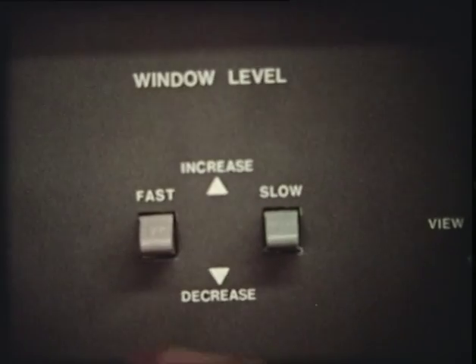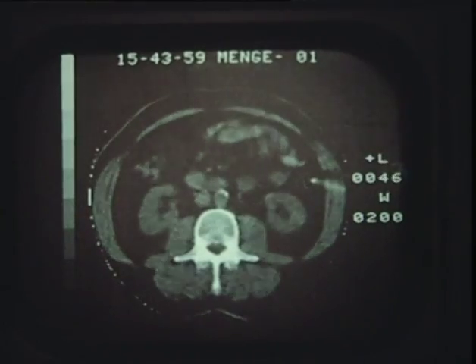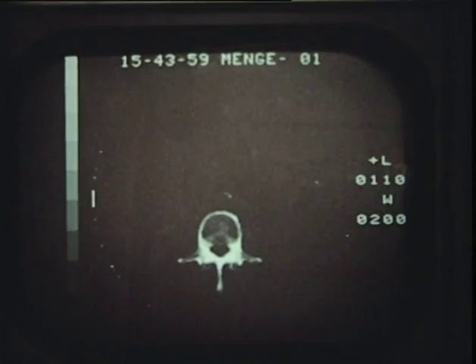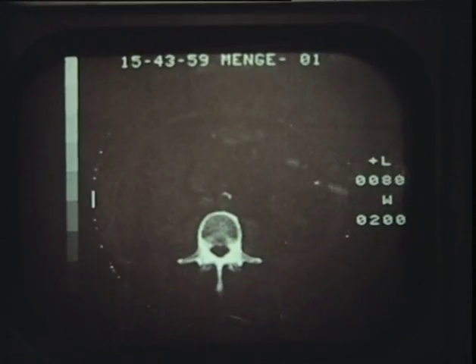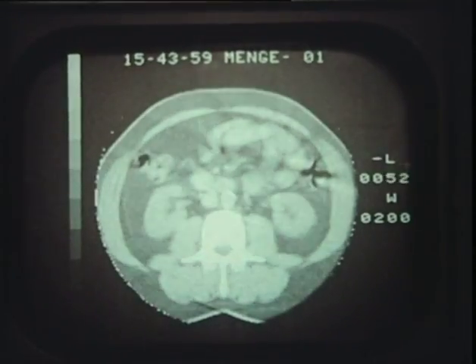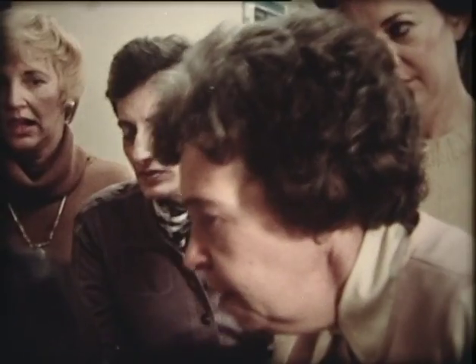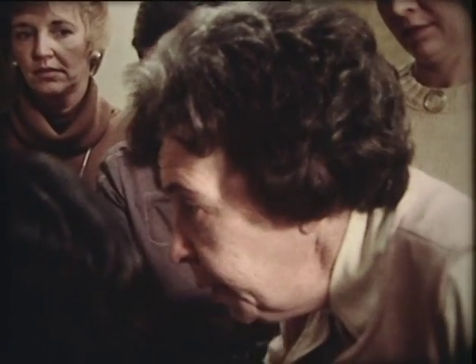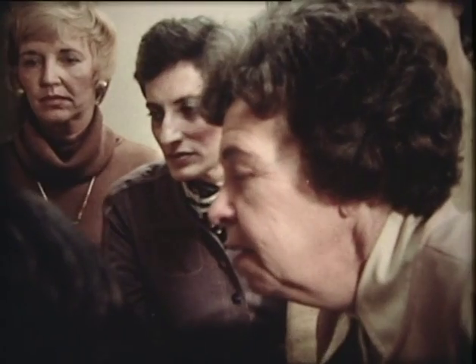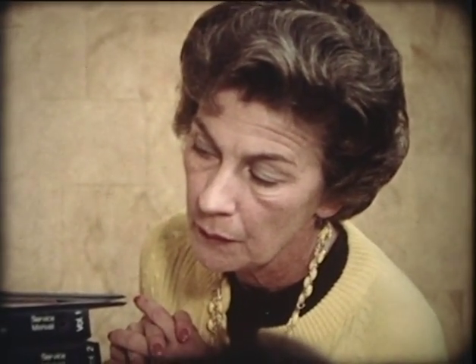We have controls that we can make the picture very dark, block out everything except calcium, which is in the spine, and make it very light. A question arose about the white marking — that's calcium in the patient's aorta, so it's probably a patient above 50.